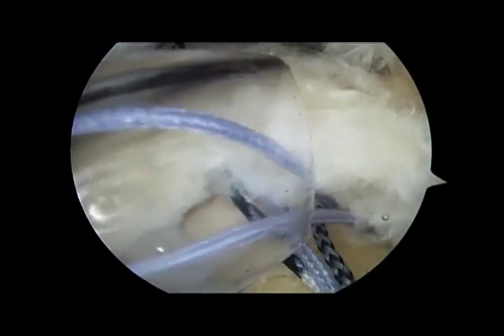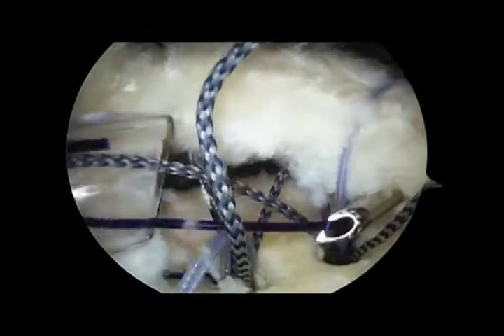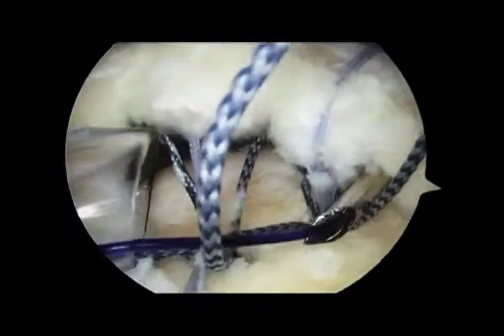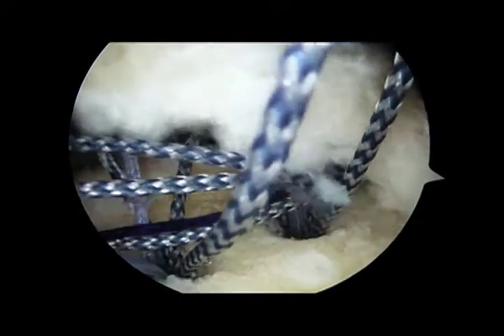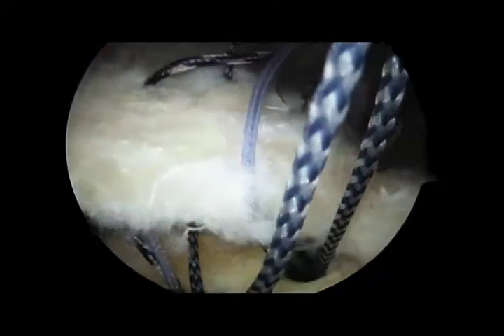Not shown is the retrieval of the medial limb of the anterior suture out the posterior cannula. The shuttling device and PDS suture are again used to shuttle the anterior suture back through the cuff and out the anterior cannula.